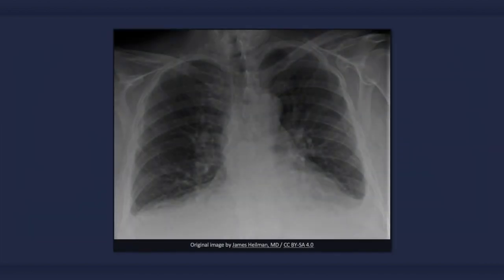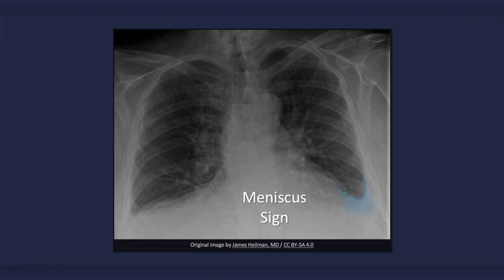Here is another X-ray of congestive heart failure. In this case there are bilateral pleural effusions, which can be identified by the loss of costophrenic angles and obscured hemidiaphragms. Below the left lung we see the meniscus sign, in which the opacity has a concave upper border and is higher laterally than medially.